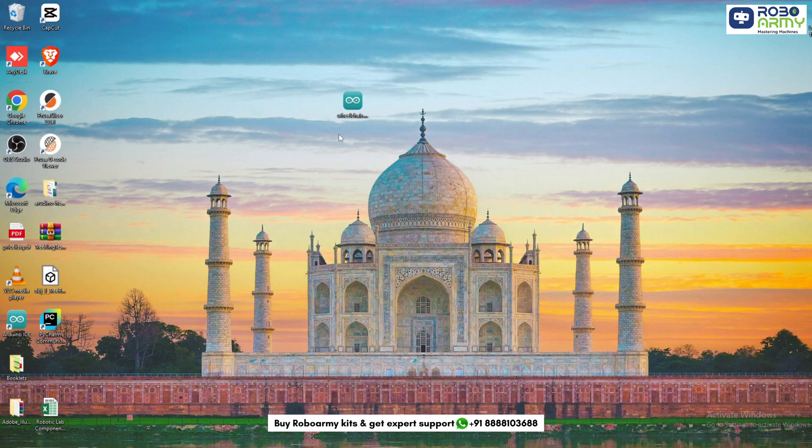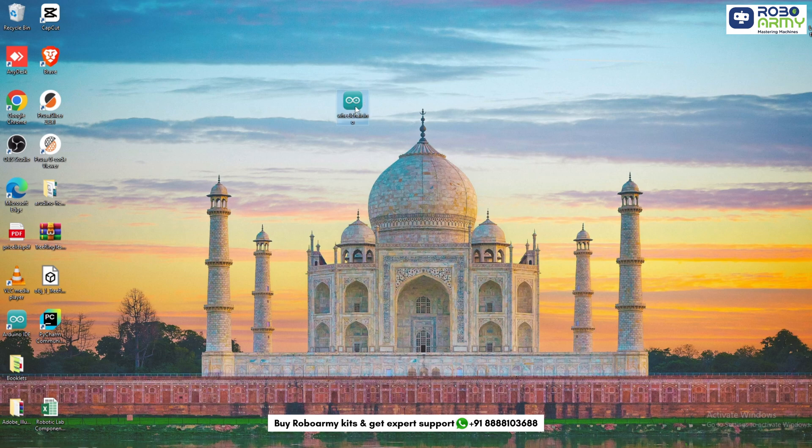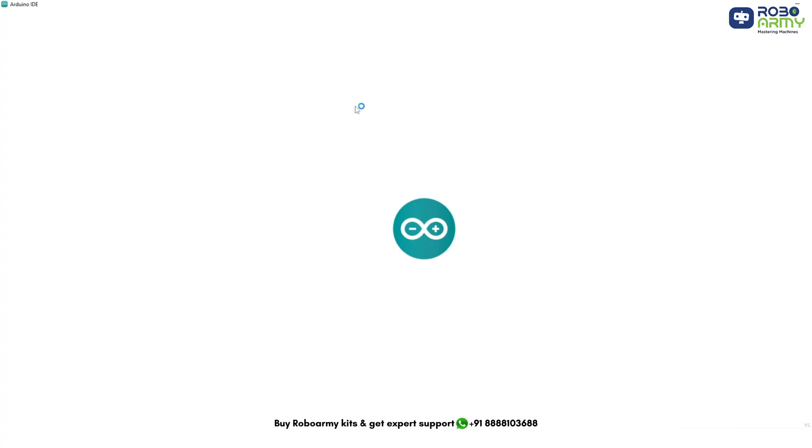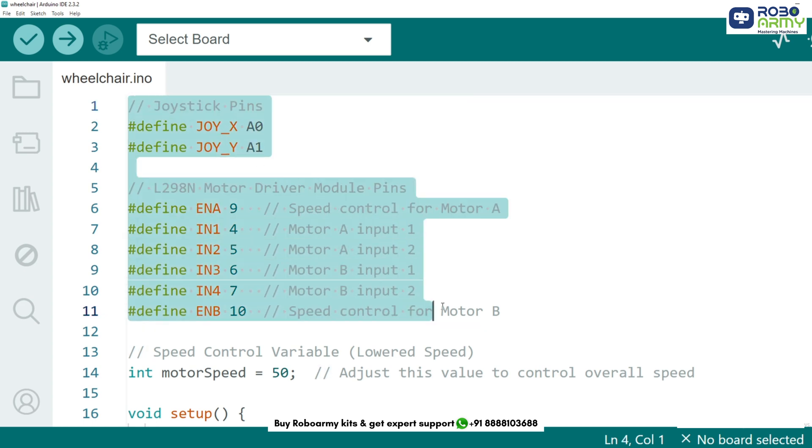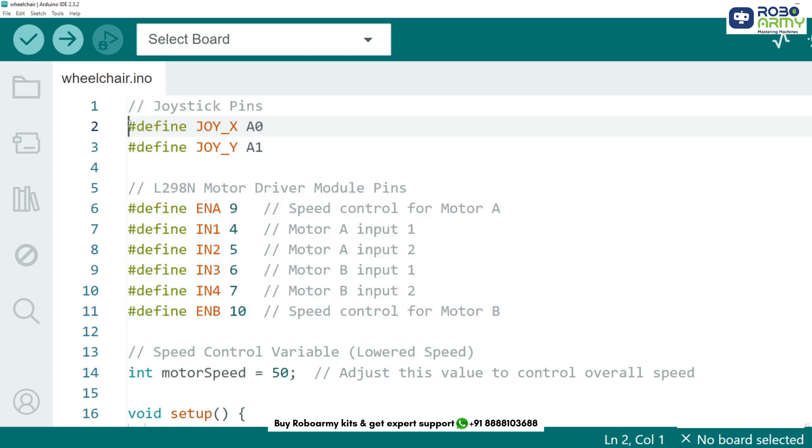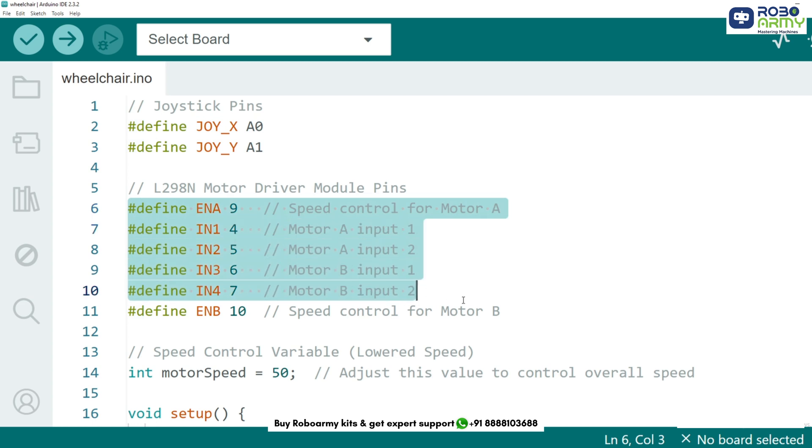Open the code file if you have already downloaded the Arduino IDE, otherwise download the Arduino IDE first. The joystick module has two analog outputs. First, we define the pin connections for the joystick and motor driver module. The joystick has two axes, X and Y. We connect them to analog pins A0 and A1. The motor driver has input pins for controlling two DC motors.